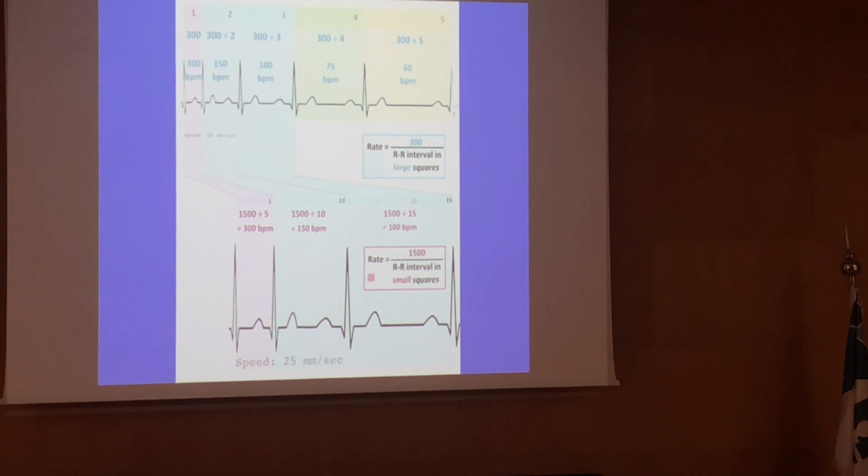So what we used to do is just take 10 seconds, see how many QRS complexes in that 10 seconds. This is how many beats in 10 seconds. I want 1 minute, so I multiply by 6. Because this is only 10 seconds, I want 60 seconds. No, don't average. Because in this case, for example, if in 10 seconds I have 10 beats, so in 1 minute, what do you expect to have? 60, right? Because 10 by 6 is 60 beats per minute. If in 10 seconds I have 100 beats, I multiply it by 6, and it will give me how many in the minute.